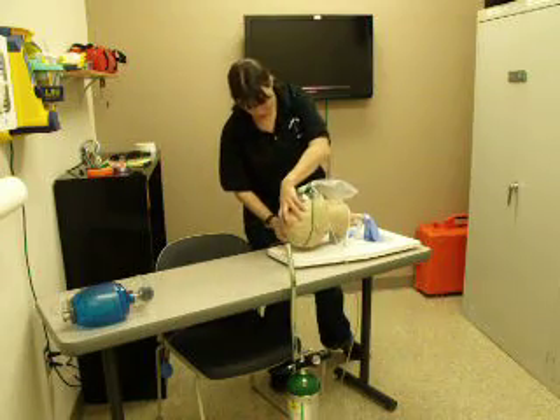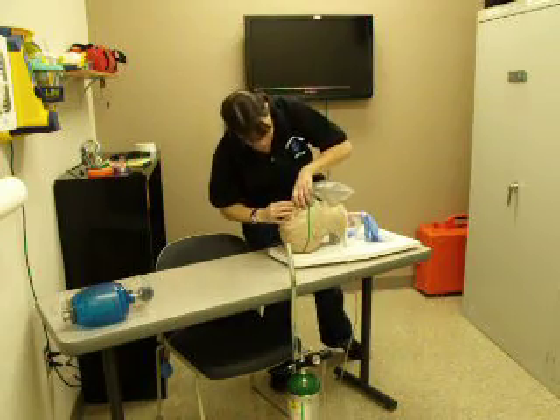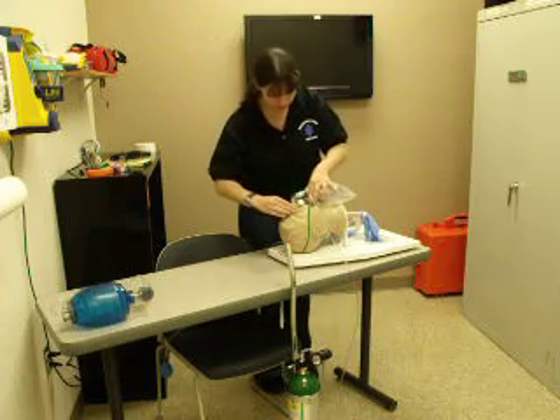Applying the mask to the patient, making sure that it fits snugly and comfortably.